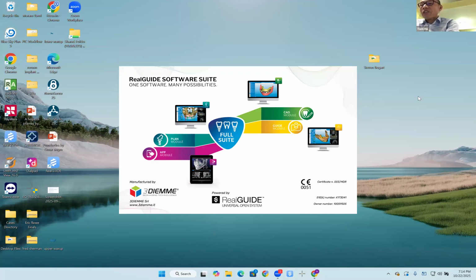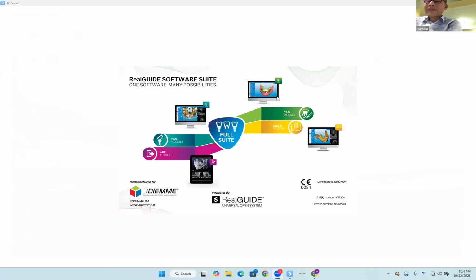Yes, I have a 37 years old patient, female, healthy. Let Dr. Hussein put on the CBCT. I'm loading it right now, sir. Okay, thank you. Yeah, it'll just take a second. Any medical issues?